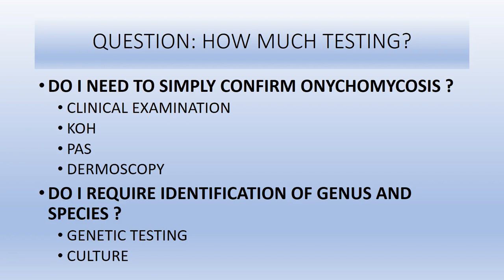If you require information as to just yes or no, is it a fungus, and yes or no, is it possible there is a mechanical component or a secondary comorbid condition, then here again KOH with PAS testing would represent the appropriate best choice in most circumstances. So hopefully this review will give you some additional thoughts on how to approach this issue of testing for onychomycosis in the average podiatry practice.